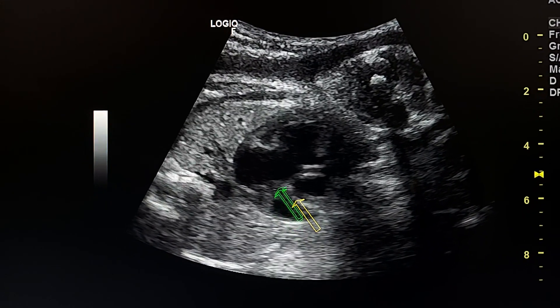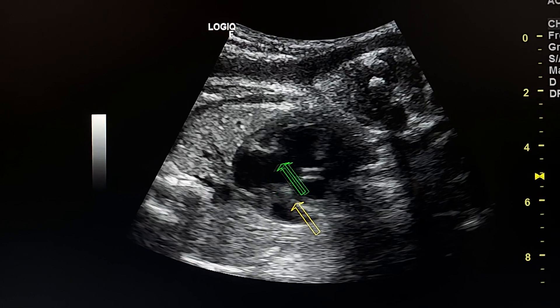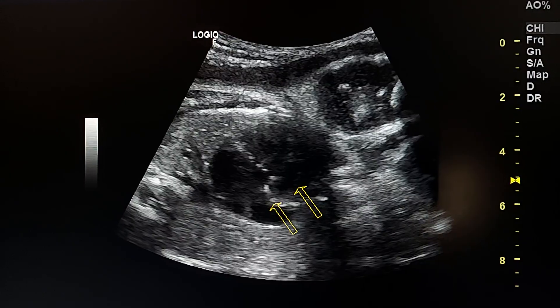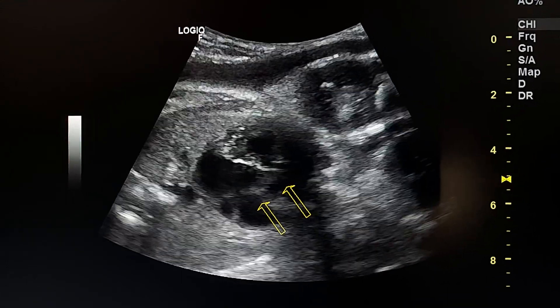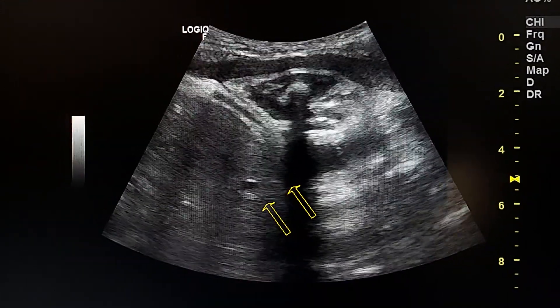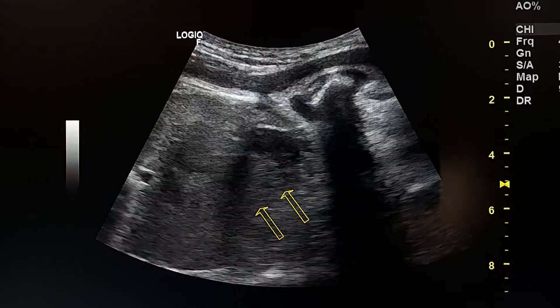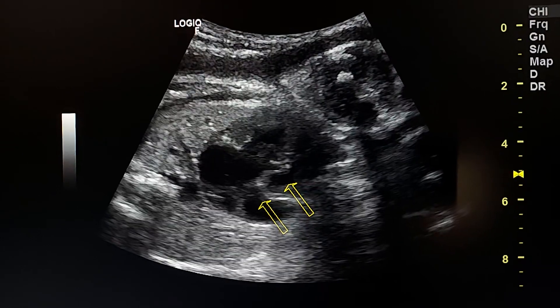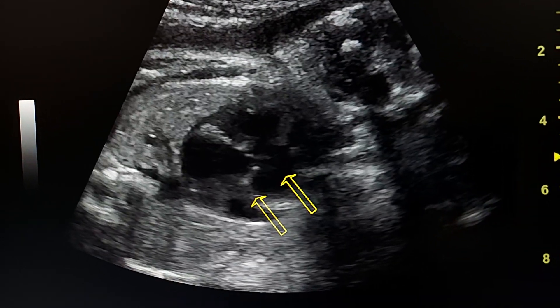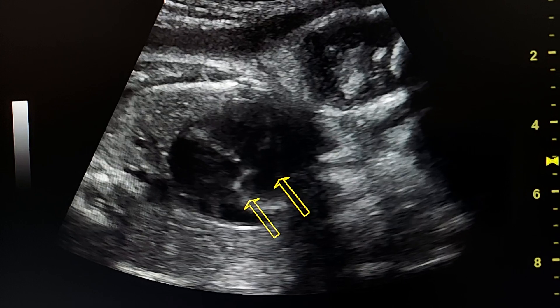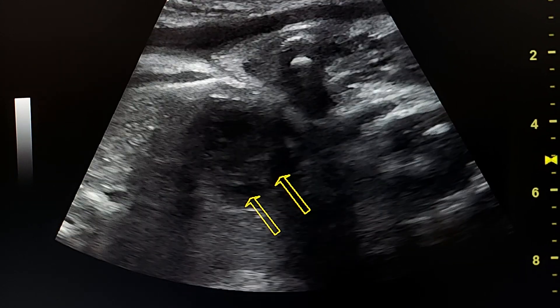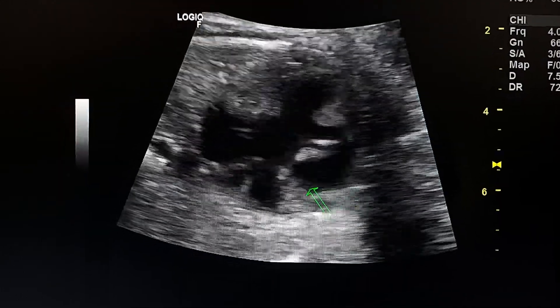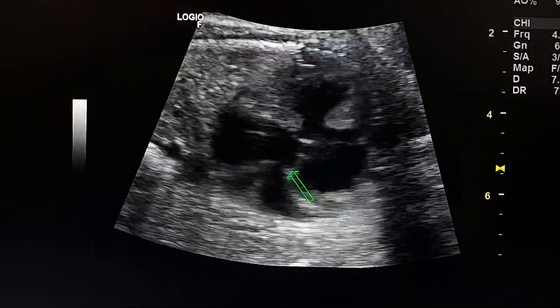This is the right atrium, this is the left atrium, this is the left ventricle, and this is the right ventricle. So we have tricuspid atresia.